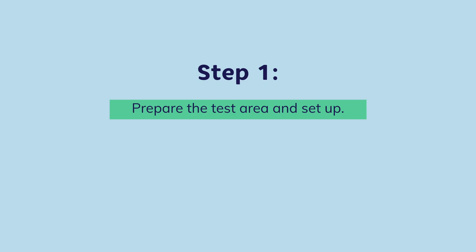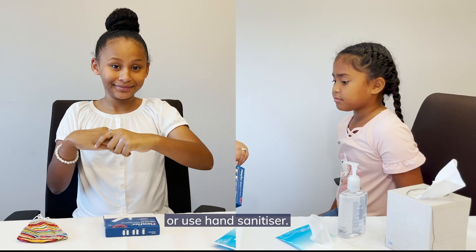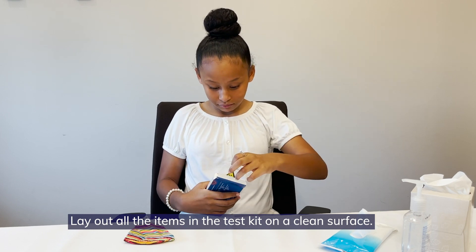Step 1. Before taking the swab, be sure to wash your hands with soap and water or use hand sanitizer. Lay out all the items in the test kit onto a clean surface.